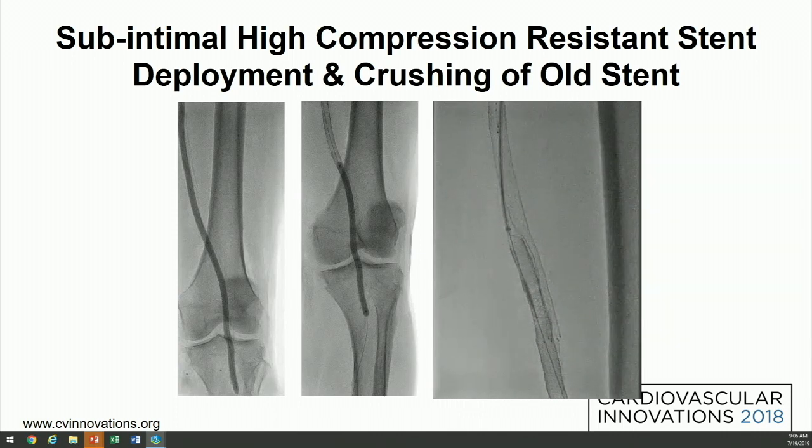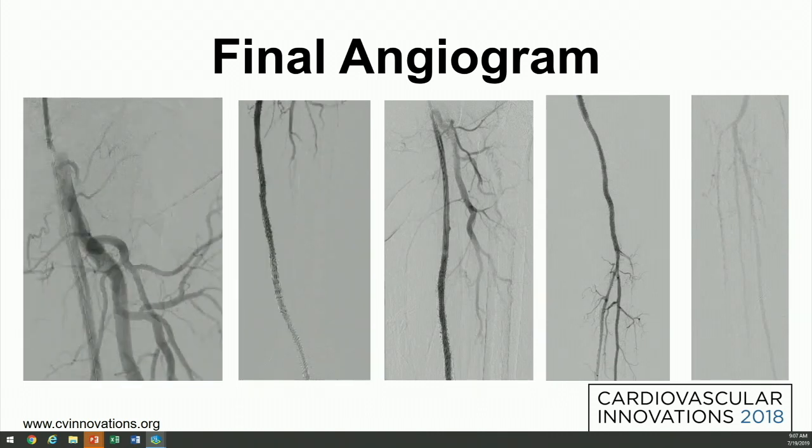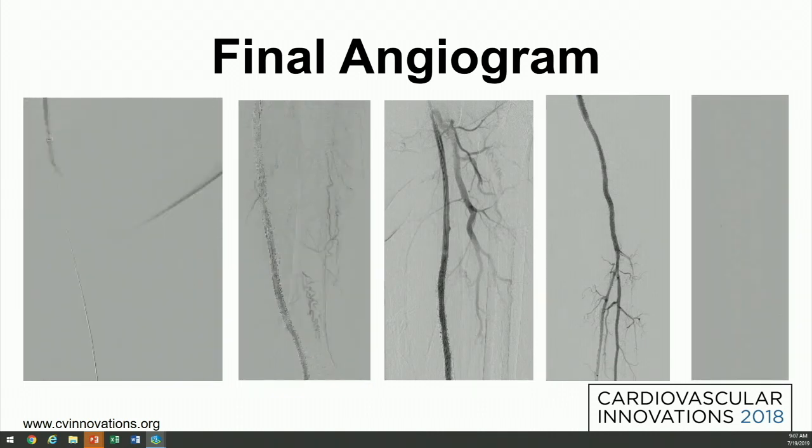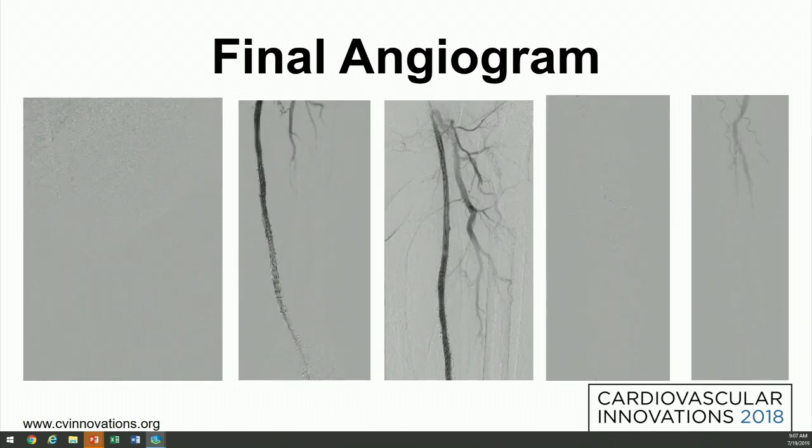And this was our final result here after we deployed our stents and post-dilated them. You can appreciate that the patient had excellent flow through the stented segment with restoration of 3-vessel runoff into his leg.